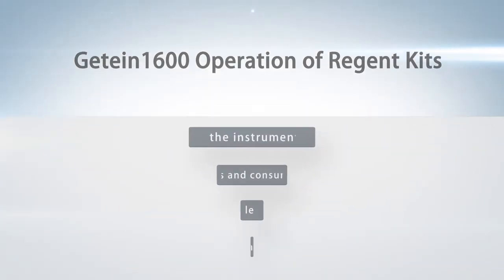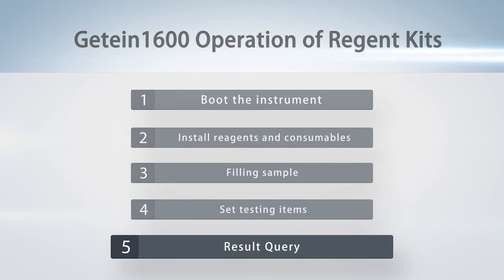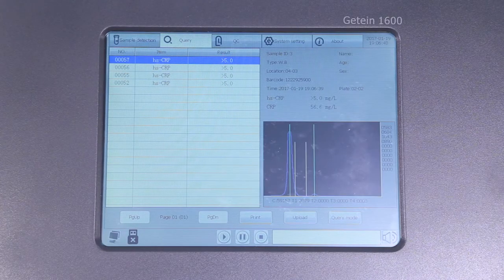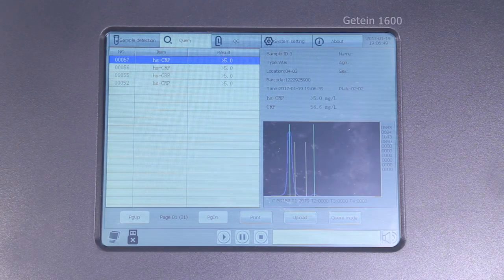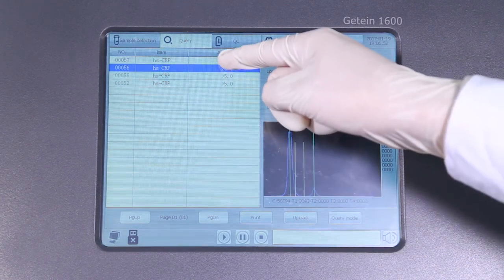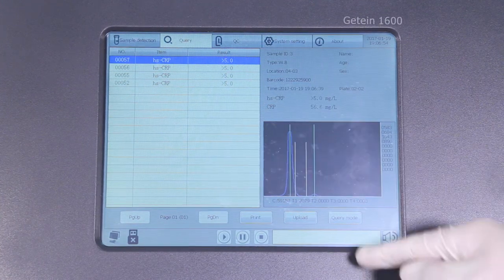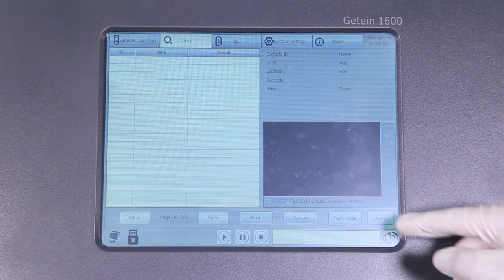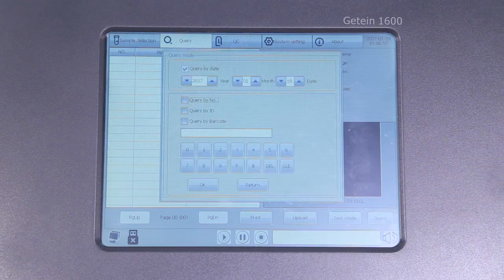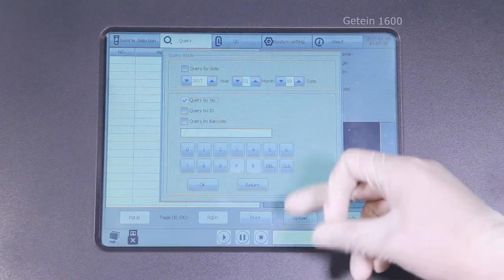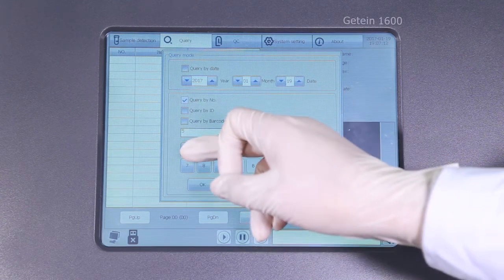Step 5: Result query. Testing results will be shown in query mode with the newest results on top. 4 query modes: Date, NO, ID, and barcode can be chosen to check historical results.